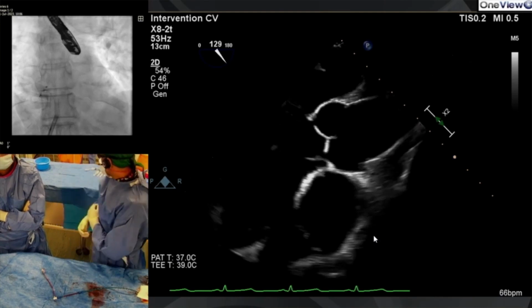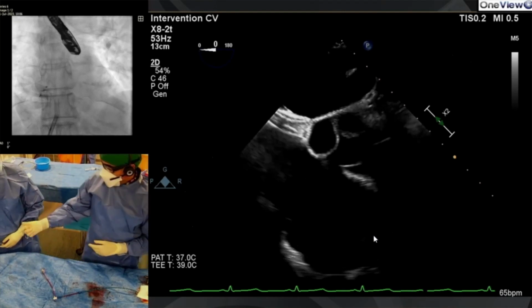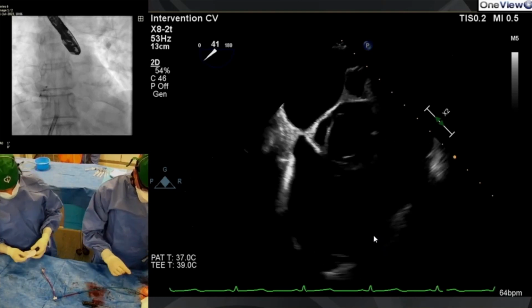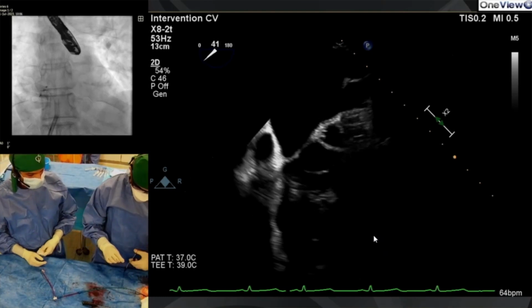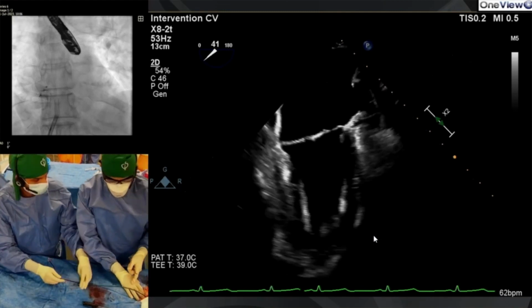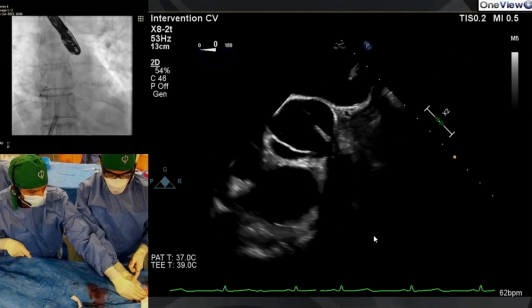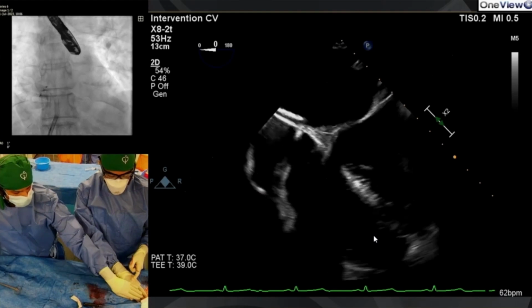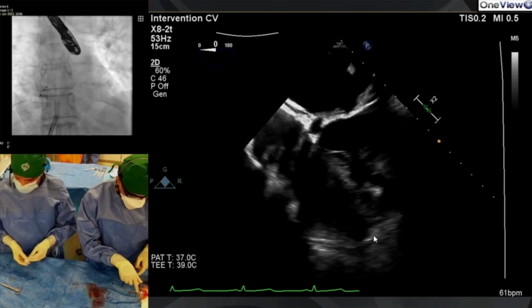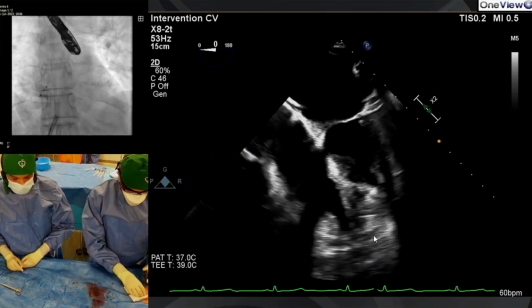The whole issue of what the value of a bubble study is another very interesting area. Trying to quantitate something that's ridiculous doesn't help. There's variable opacification of the right atrium, there's variable Valsalva, and you only are taking a thin cut with an ultrasound beam and not sampling the volume of the left atrium. And so you can drive yourself and the patients fairly crazy with bubble studies, depending on who your echo technologist is who does the echo. So I think all those points come up in the care of these patients.